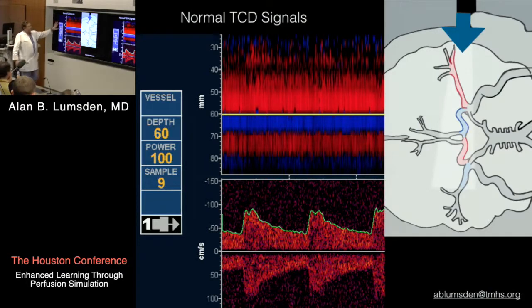So think of this as telling you, everybody gets completely focused on embolization. I've not even mentioned embolization yet. Take it off the table. Think of it as it tells you baseline flow and flow direction. That is incredibly valuable in its own right, if nothing else. I can tell you that patient who had the type A dissection, who was being perfused, probably had no flow intraoperatively, was not perfusing their head, and I could have told that surgeon that immediately. I could have told the perfusionist that immediately.